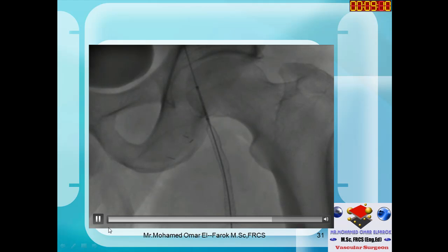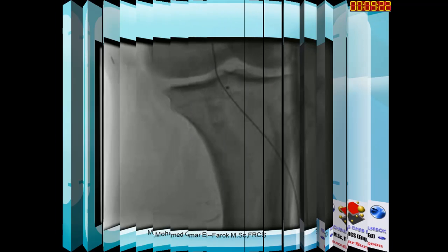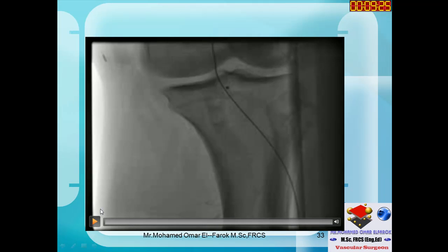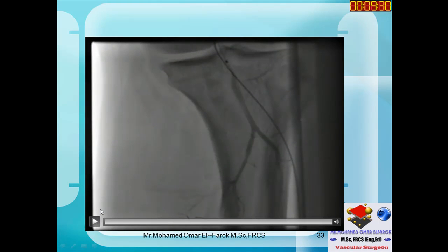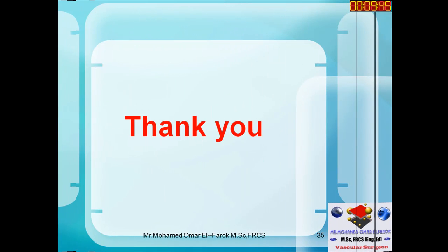After angiography, you can see good flow into the upper part of the superficial femoral artery. Checking the lower end at the popliteal artery shows good distal flow as well. In summary: good experience comes from bad judgment and good judgment comes from bad experience. Thank you very much for your time, and I hope this is useful to all vascular surgeons.